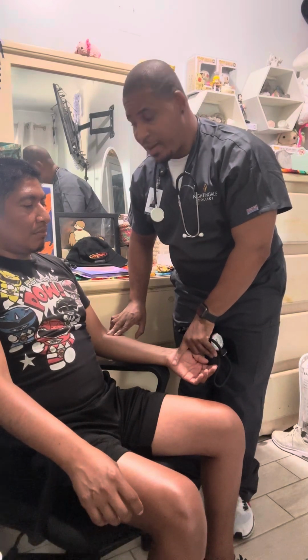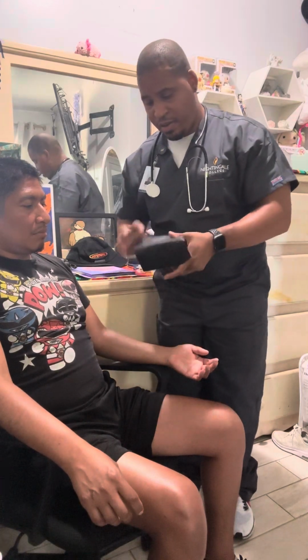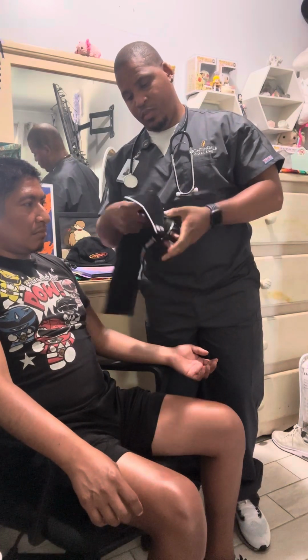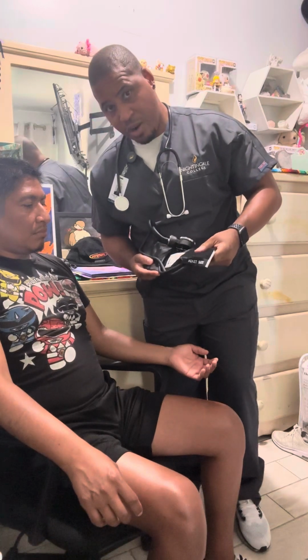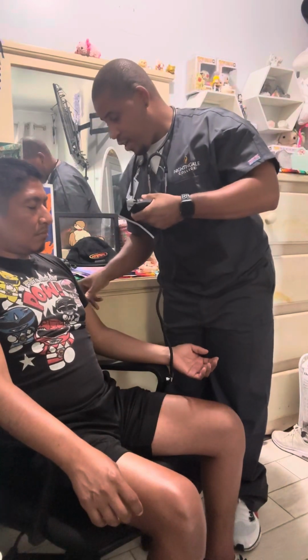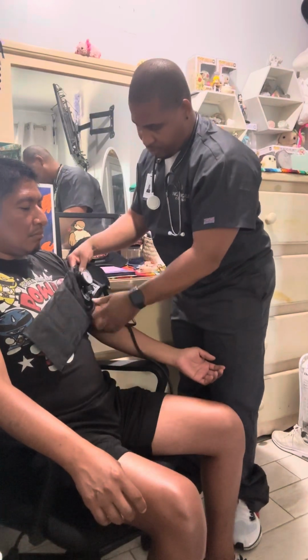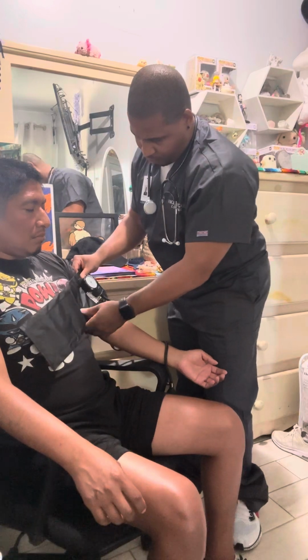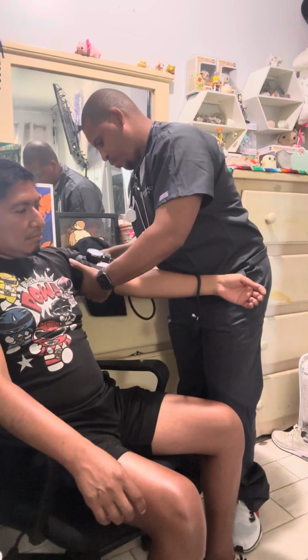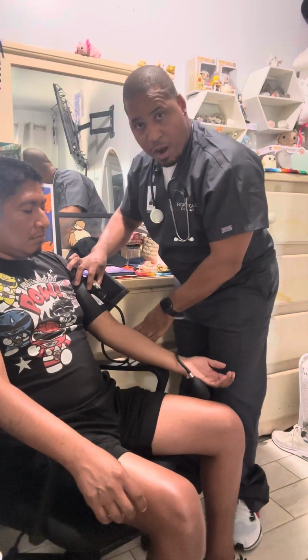And once I've identified it, I want to place the cuff, which I'm using his left arm, I want to place these arrows, and I want to place the cuff itself 2 inches above that point. Making sure I can see the sphygmomanometer for his reading.